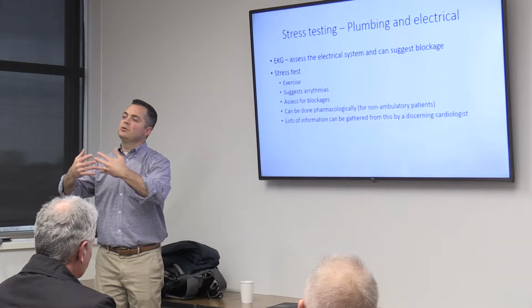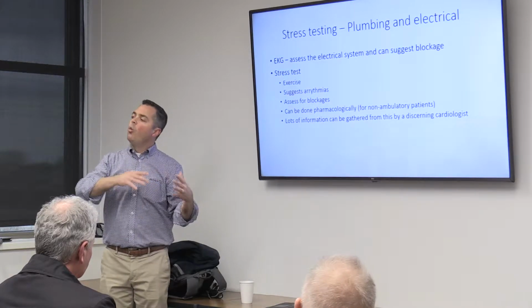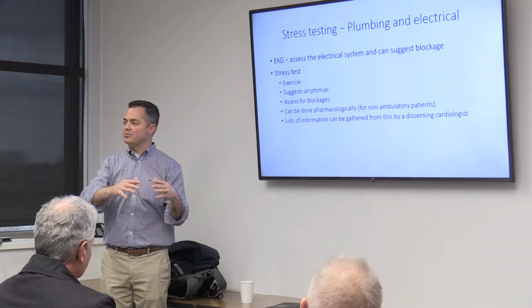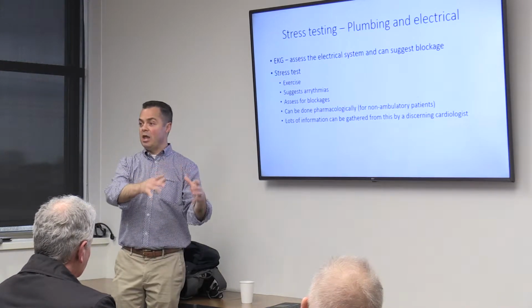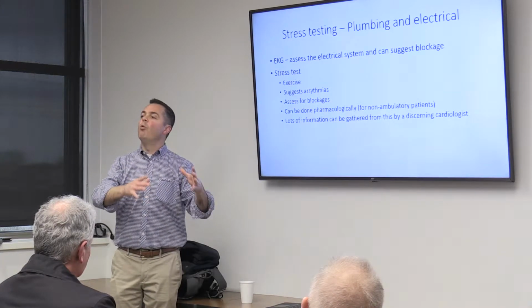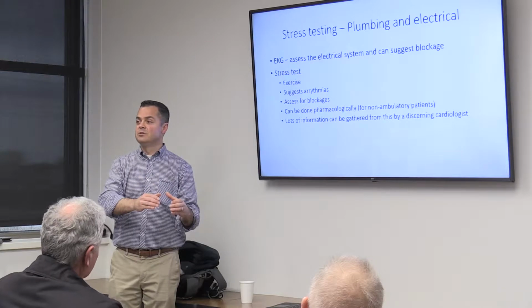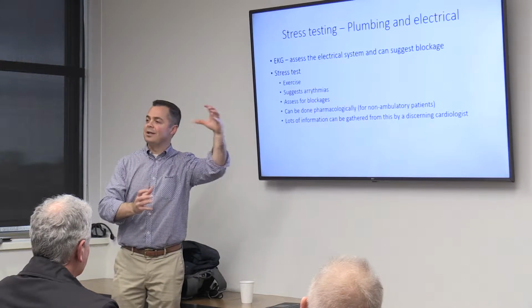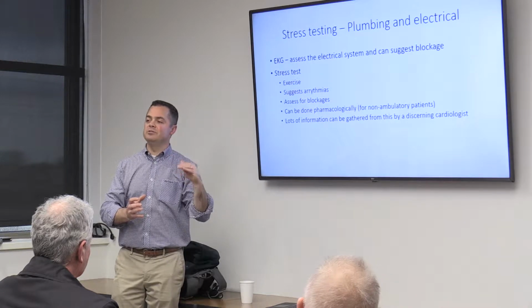Well, if you took a bunch of women and put them on a treadmill, women tend to have more falsely positive EKG changes when they exercise. So there are changes on your EKG that we look for that tell us, aha, this patient has blockage. Now, it's not 100% accurate, it's a suggestion, okay? But women tend to have more false positive EKGs. So sometimes women will end up with more stress tests with the imaging portion layered on top because the provider might be worried she's gonna have a false positive EKG.